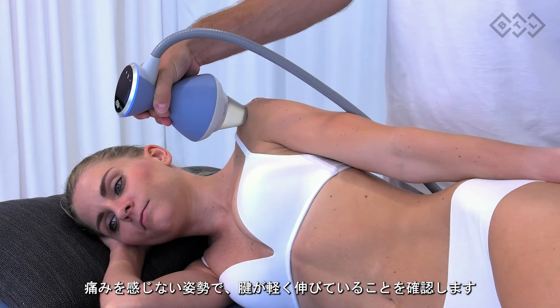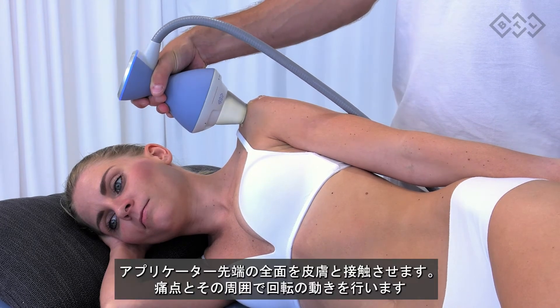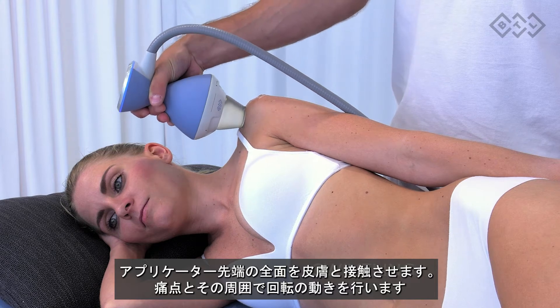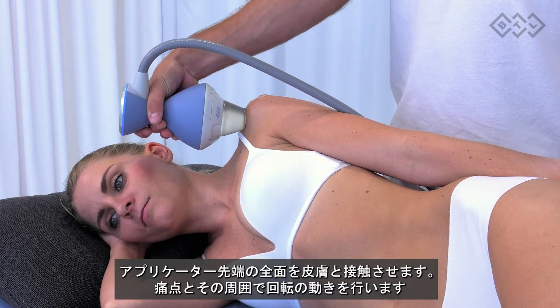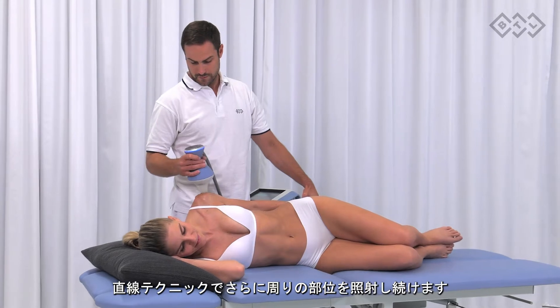Painful shoulder. Make sure that the tendon is gently stretched but not in a painful position. Apply full contact therapy and perform swiveling movements in the most painful spot and its proximity. You can continue with the painting technique to treat the surrounding area.